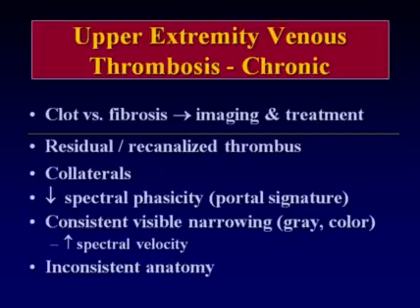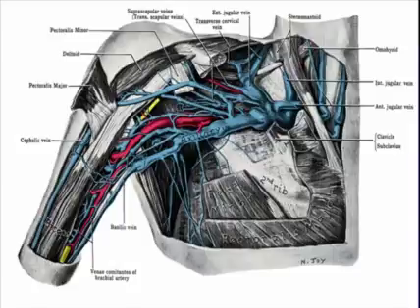Always look for consistent anatomy. Look for the adjacent artery so that you know that you're dealing with the adjacent large vein rather than a large collateral that is formed. As I mentioned, there is the potential for the opening of a very rich collateral bed all throughout the upper arm and shoulder area. Even in the jugular area, it's remarkable how patients can open up huge collateral beds across the neck when there is blockage on one side.